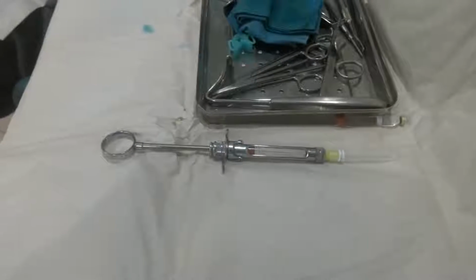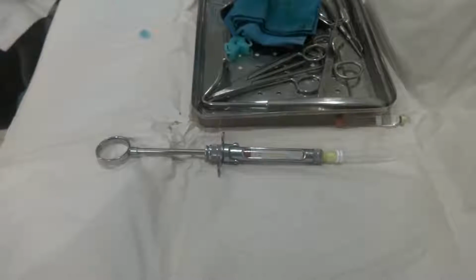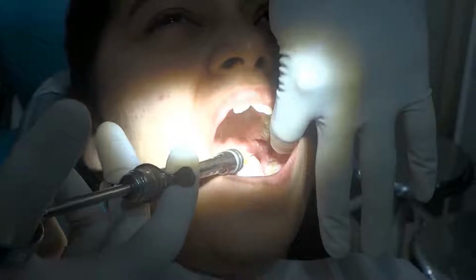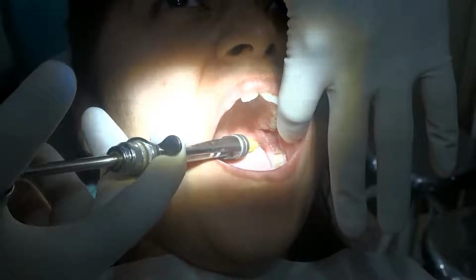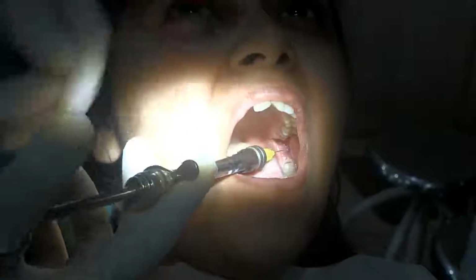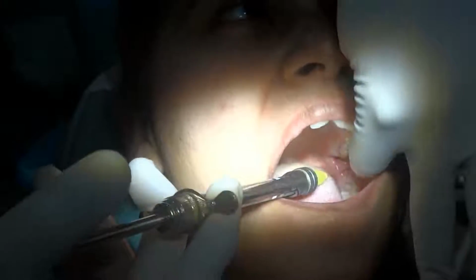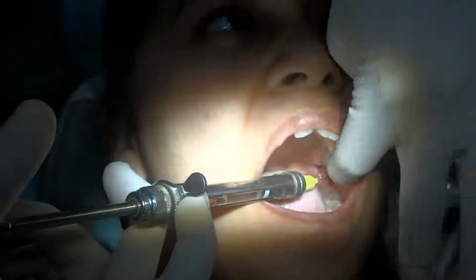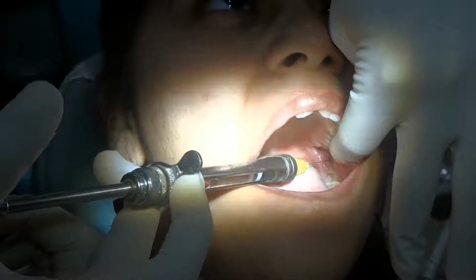The LS syringe with cartridge and needle is ready for local anesthesia administration. The needle has been inserted into the pterygotemporal depression. Aspiration is being done. The aspiration is negative. And now local anesthesia is being injected.